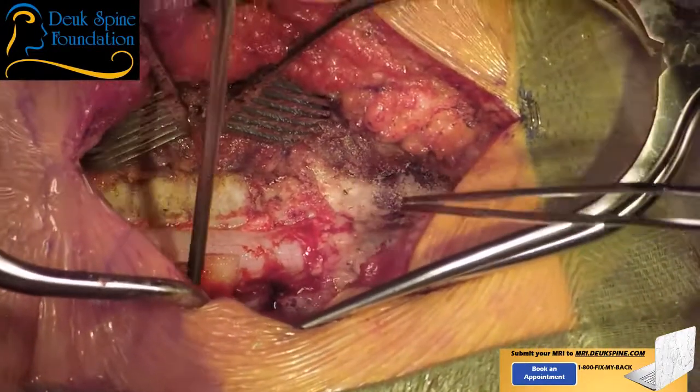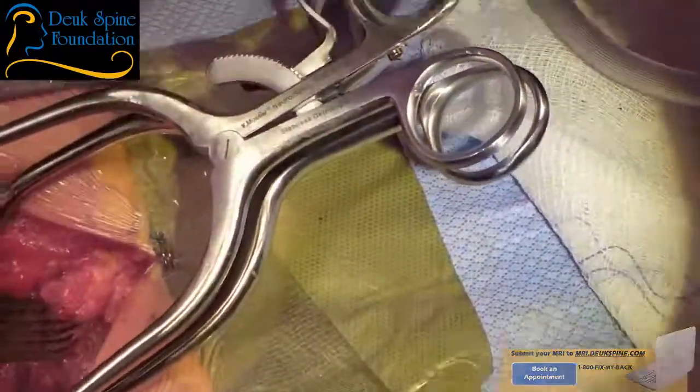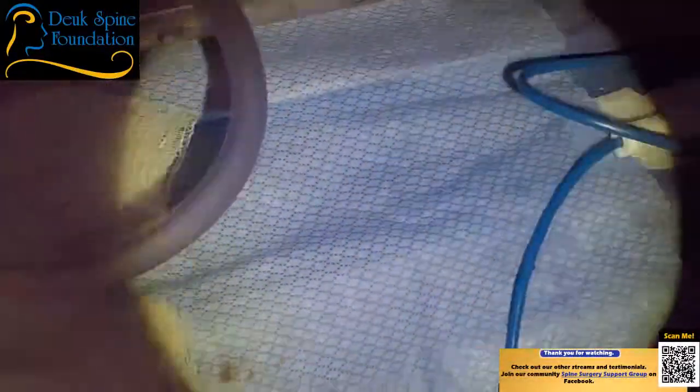Yeah, that's the ligamentum flavum. Right. So the ligamentum flavum goes lateral into the foramen, becomes the foraminal ligament. That's hypertrophied. Absolutely. So it's pushing on the nerve root from behind, shoving it forward. Yes. So we're going to get rid of that. That's part of our foraminotomy.